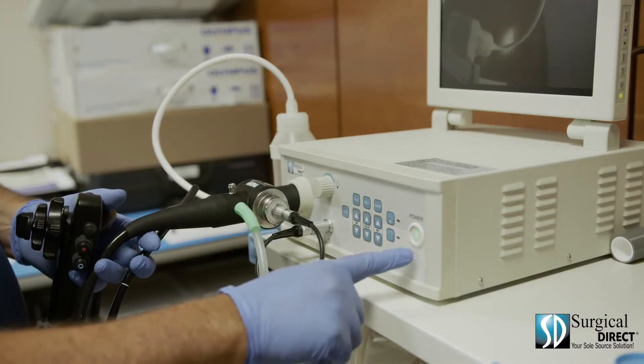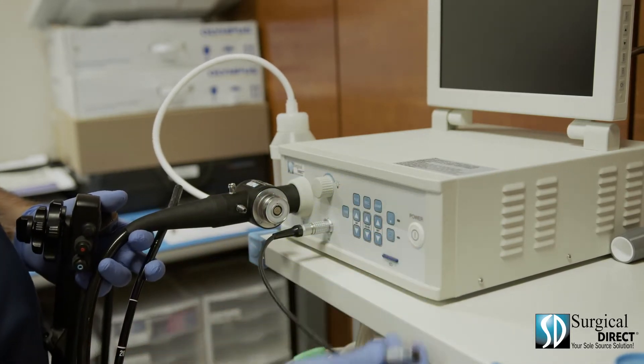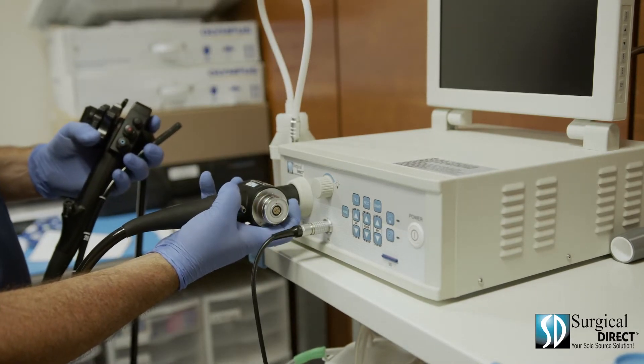To disconnect the scope, turn off the power, disconnect the suction hose, disconnect the video cable, the water cable, and gently pull the scope out of the processor.